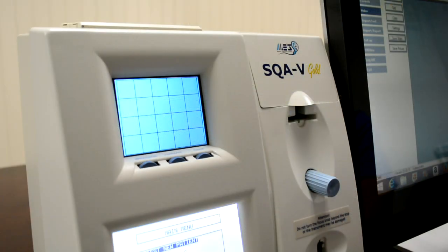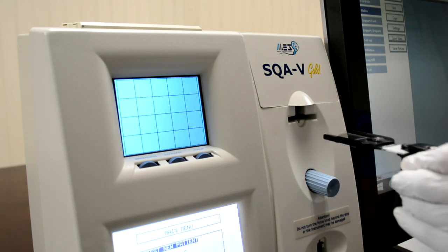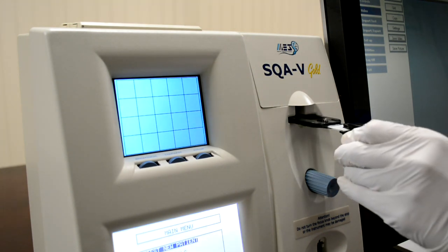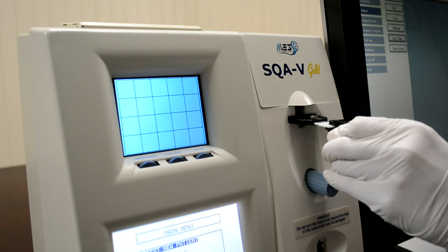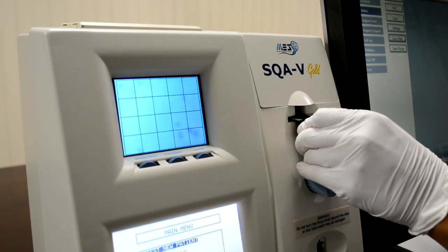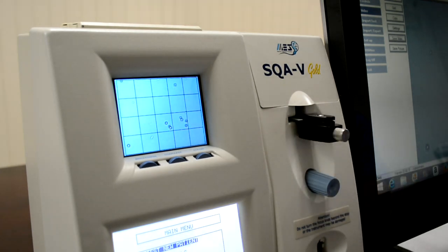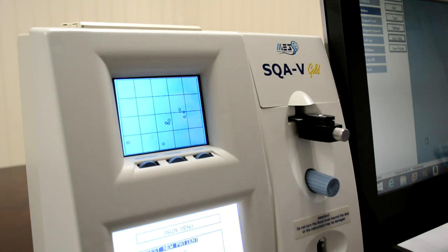Now, insert the slide adapter with your prepared slide into the visualization chamber as shown. Make sure it's pushed all the way in and is nice and secure. If your image is out of focus, adjust the blue focus knob.